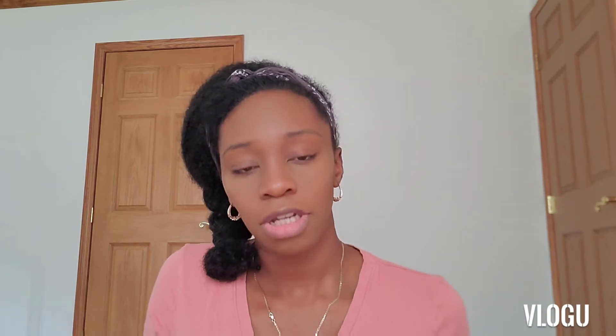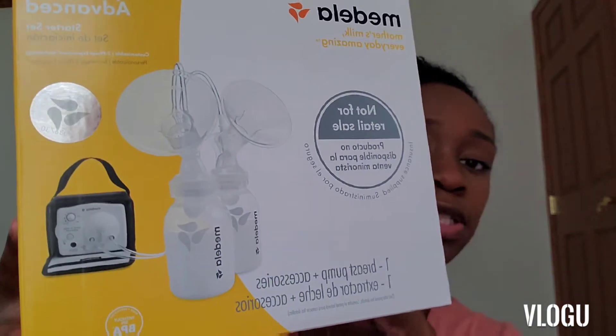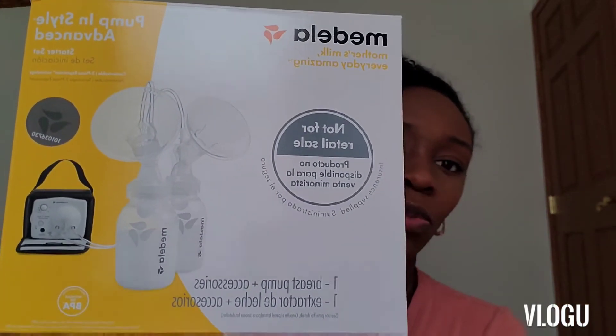Then I'm going to be opening this. I got this at the hospital — it's a Medela breast pump — for work, because I'll be going back to work in about a week and a half. I've been putting off opening it for eight weeks because I don't want to open it, because that means I'm going back to work.